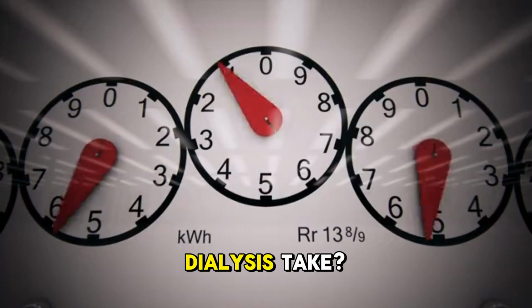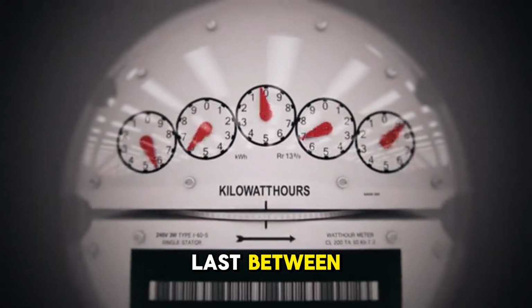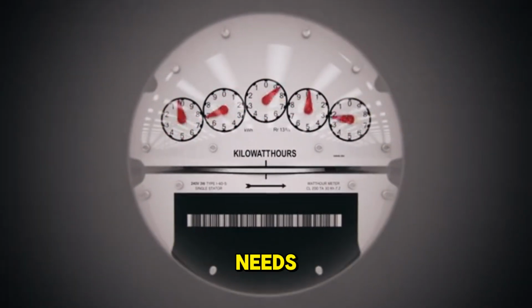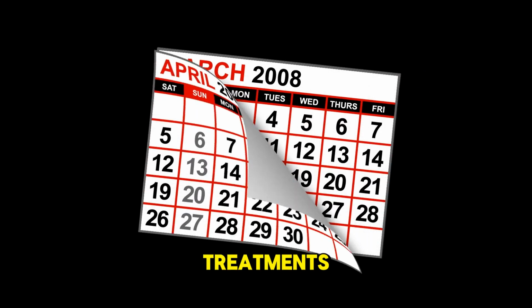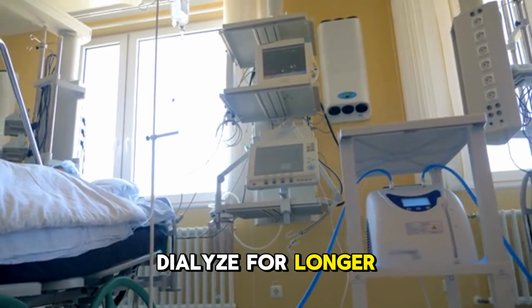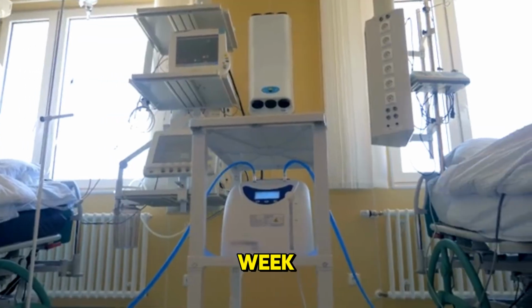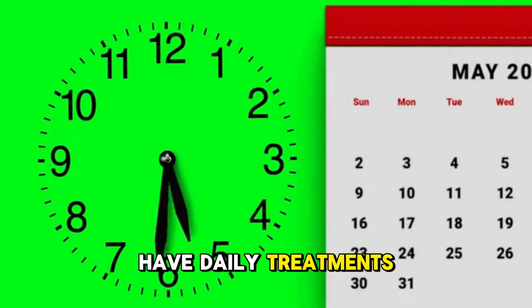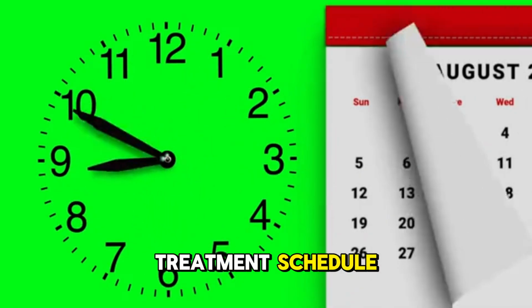How long does dialysis take? Most dialysis treatments last between 3 and 5 hours, but the length of your treatment depends on your needs. You may need more frequent shorter treatments or fewer longer treatments. You may even receive at-home dialysis so you can dialyze for longer periods of time. You may have treatment 3 times a week, each session lasting 4 hours. Or you may have daily treatments lasting about 2 hours each. Your doctor will determine your treatment schedule.